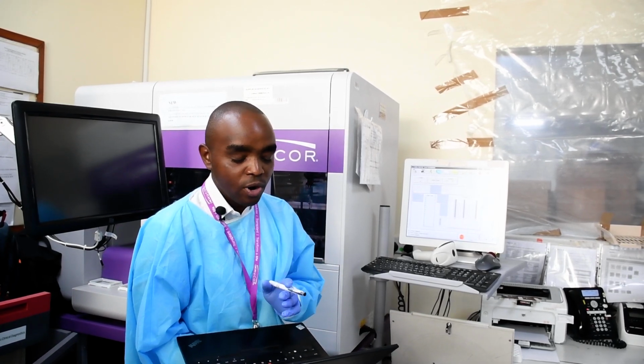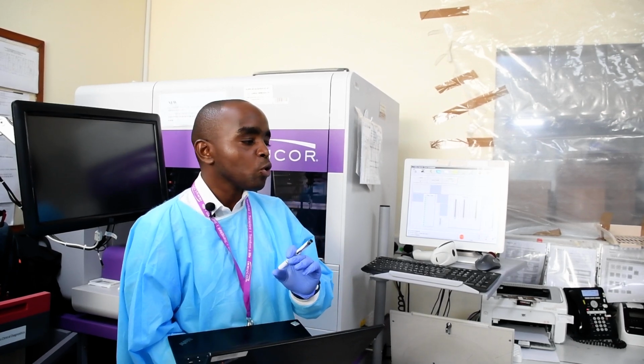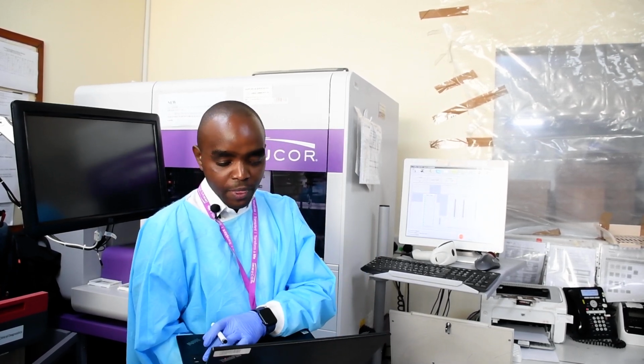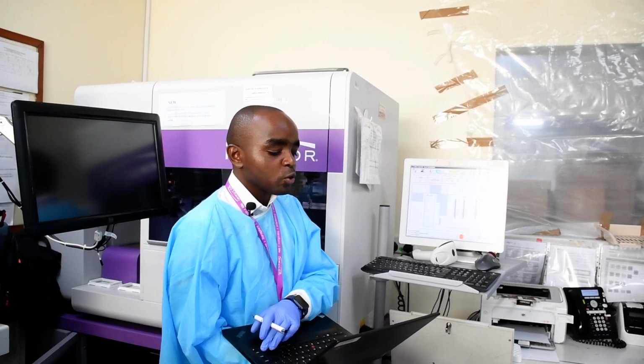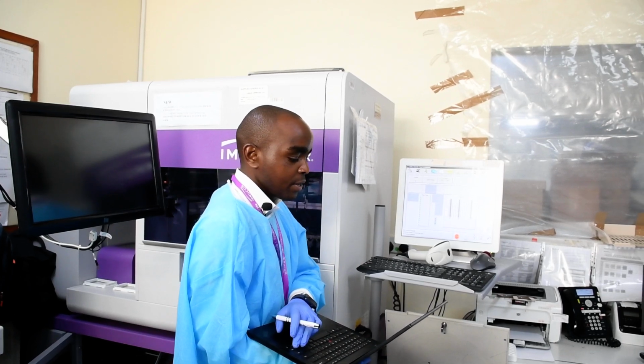Platelet transfusion, organ transplantation: these are the applications where you need at least to consider the ABO titers for all blood group O donors.